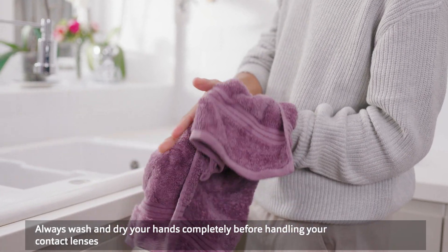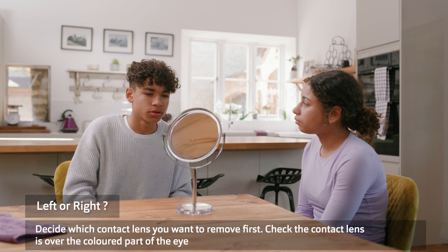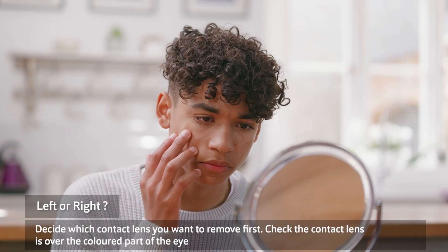Before touching your contact lenses, first decide which contact lens you want to remove first — left or right. Once decided, look straight ahead in the mirror and check that the contact lens is over the colored part of your eye.